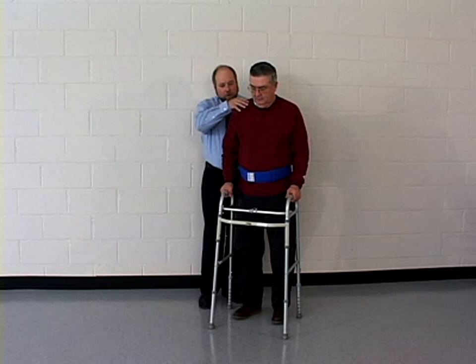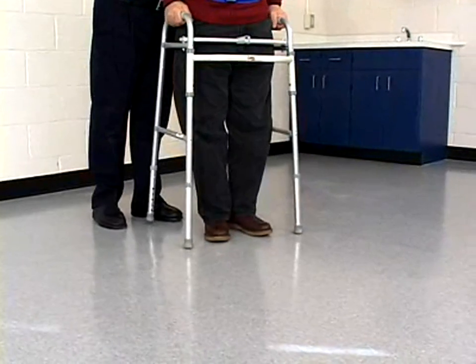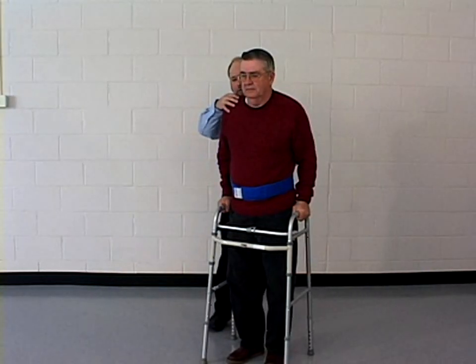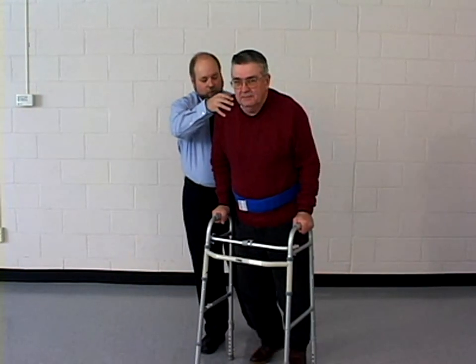Patients who must ambulate using a swing-to gait pattern also stand centered in the walker. The therapist is positioned in stride, behind and to one side of the patient, grasping the gait belt and shoulder of the patient. The walker is moved forward and the therapist advances his right or outside foot. The patient lifts his body by bearing weight through his upper extremities and depressing his shoulders while pushing down on the hand grips of the walker.